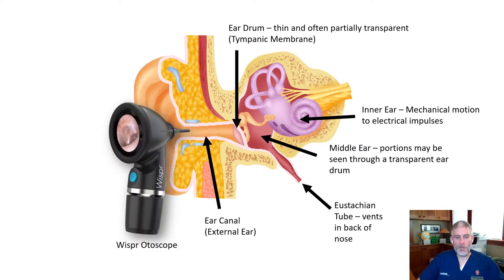The otoscope examination occurs when the otoscope is placed in the external ear canal to view the eardrum. And oftentimes, because of the transparency of the eardrum, you can actually see the structures behind it, as we'll point out in this presentation.